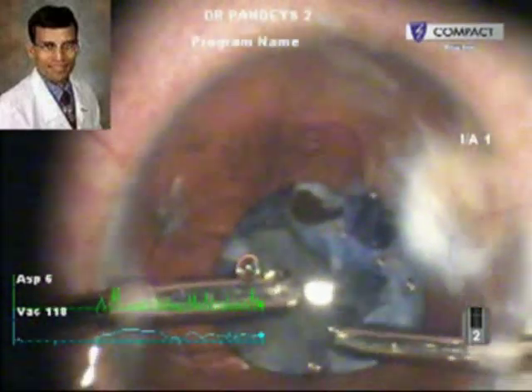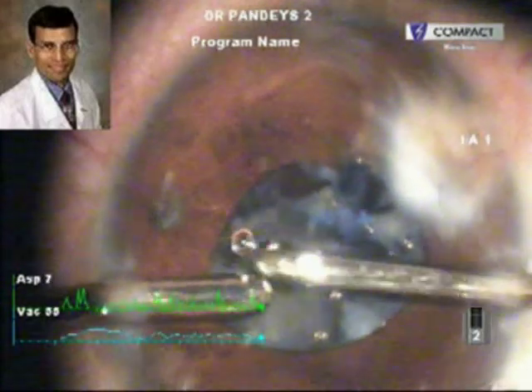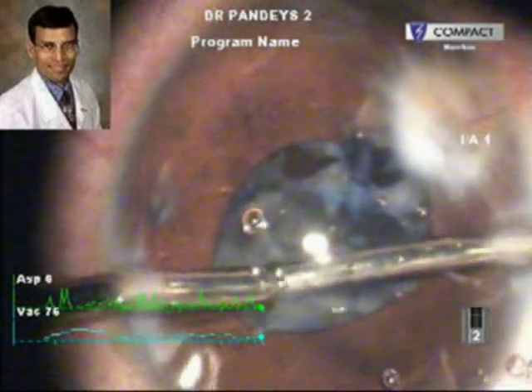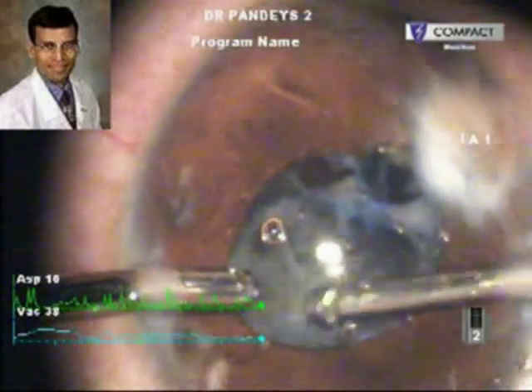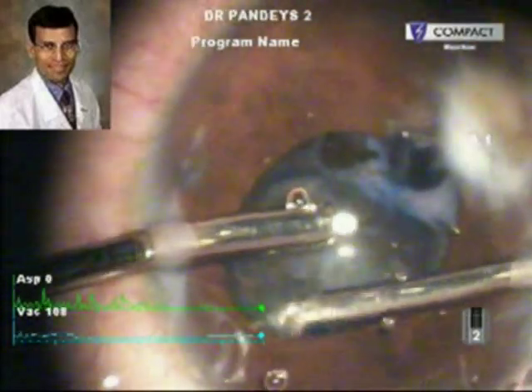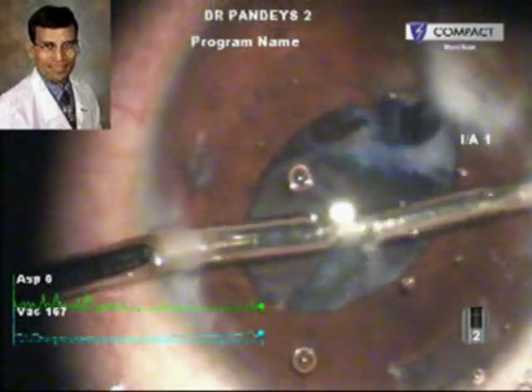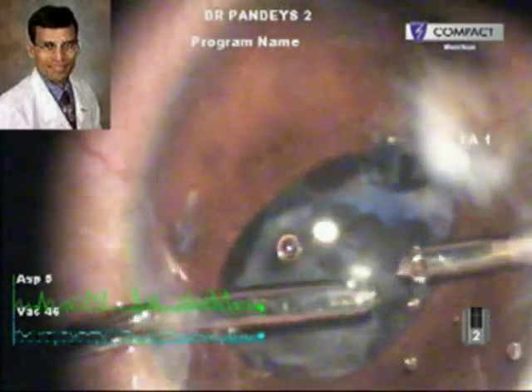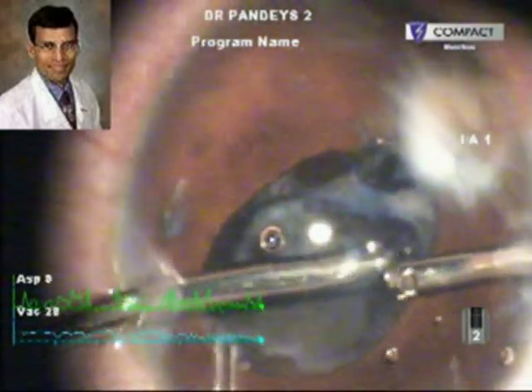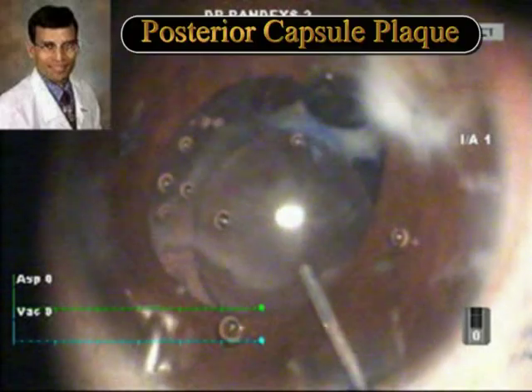These cataracts as a rule are quite soft and can easily be removed using irrigation aspiration only — phacoemulsification is hardly ever needed. This is a 9-year-old child, so it was quite obvious that the cataract would be soft. But because of the history of trauma, the strands were still difficult to remove because the pupil was not fully dilated, and therefore the irrigation aspiration was performed carefully to avoid any further injuries.